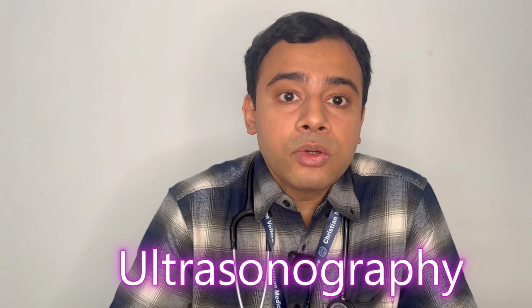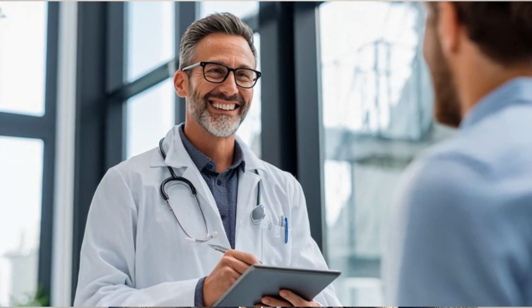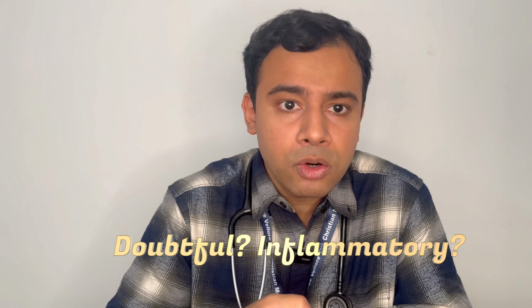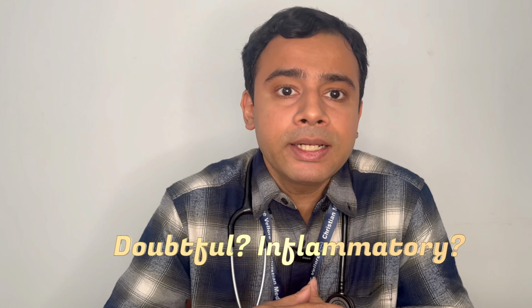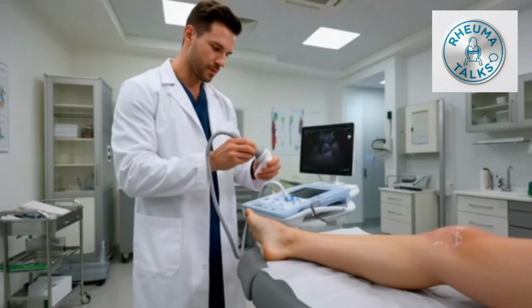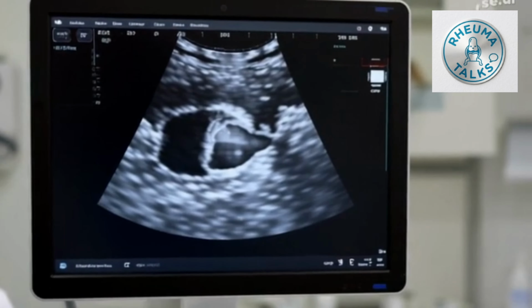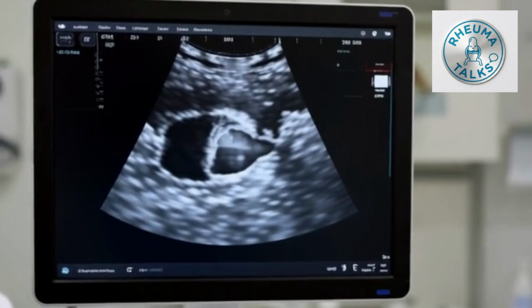Okay, then the next imaging modality we have is your ultrasound. Okay, ultrasound also is a very commonly done test in our daily rheumatology practice. Okay, sometimes we get patients who don't have a very classical clear-cut history of inflammatory arthritis. Okay, when we have a doubt in such cases, we can always do an ultrasound of the joint, predominantly to look at the synovium. So that will show us if there is any evidence of active synovitis or if there is any evidence of erosions in your joint. Okay, so this idea we can get using your ultrasound.